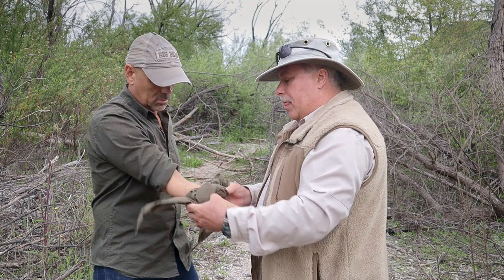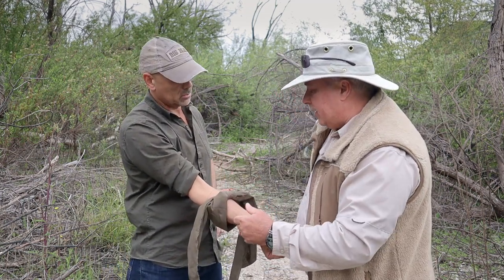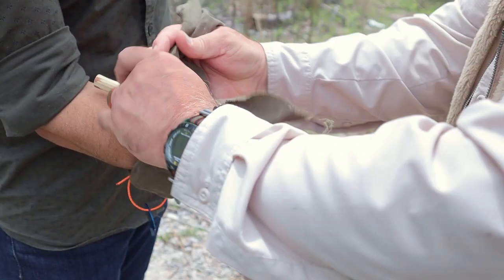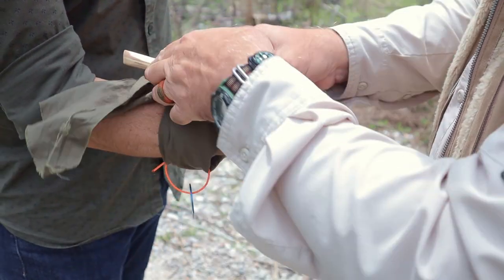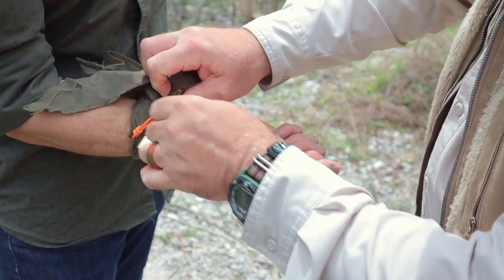Tighten this guy up. One overhand knot right there. Then I'm going to take a stick you can find on the ground, put that in, do a secondary overhand knot right on top of that stick, and this is where you crank down. You just turn it until the bleeding stops.